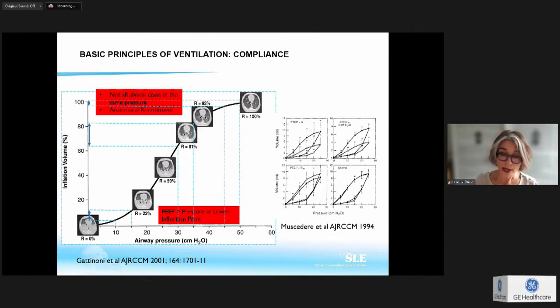So you see this one, it can help you at the bedside. If you increase, for example, your PIP, you see a gain in tidal volume, a little bit of gain. But when you look at your compliance, you see that the compliance is going down. It tells you that you maybe went too far here.